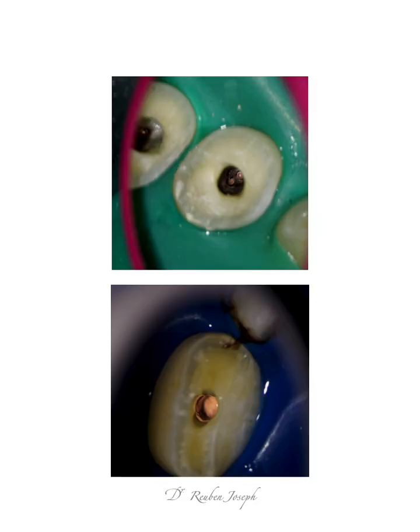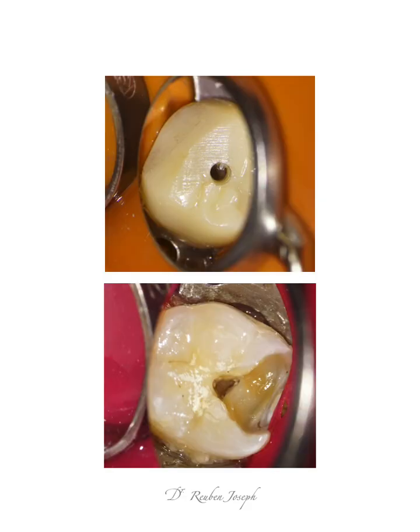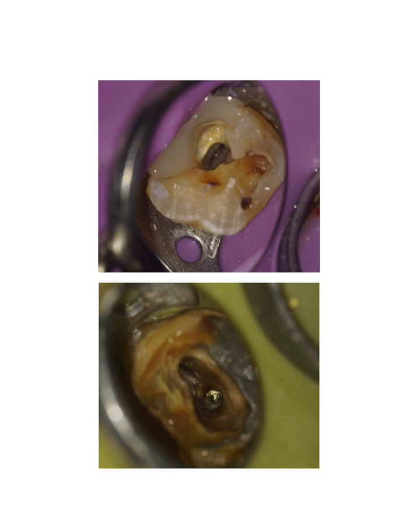Of late, many colorful rubber dams have been introduced in the market, and I really don't know why. I have tried them all, and the image outcomes have been very average. What happens here is either they tend to suck off the light or divert the attention from the tooth to themselves, being as colorful as they are. I'm sure you can appreciate the same after having looked at these images.